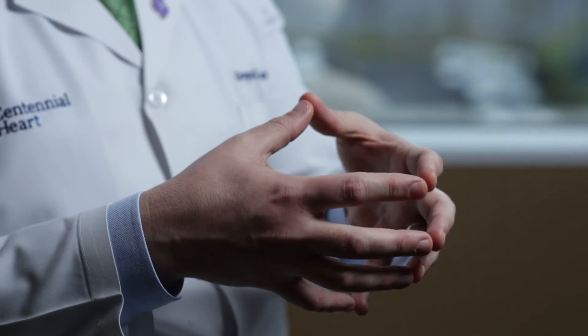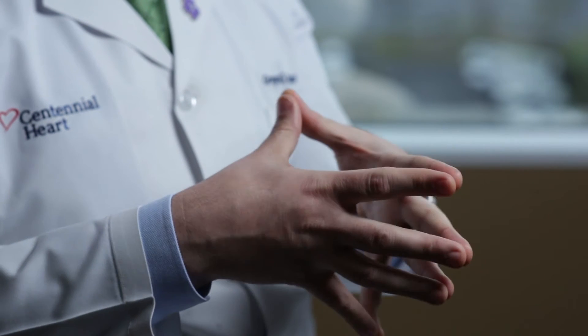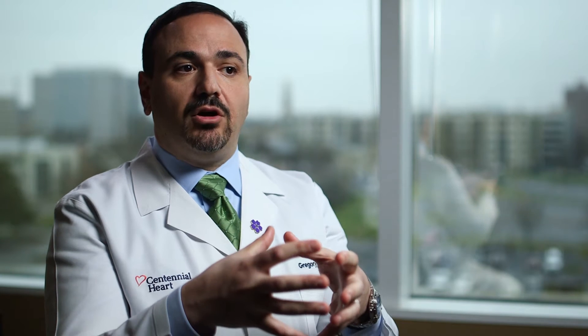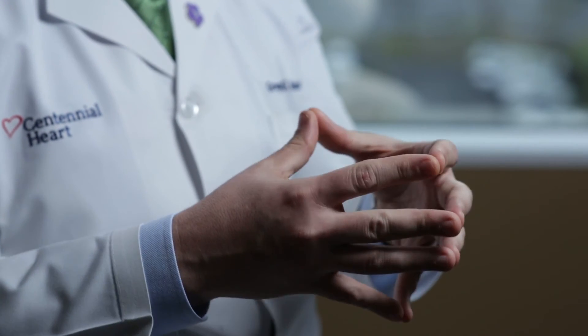Cardiac resynchronization, or biventricular pacing, refers to a special kind of pacing of the two bottom chambers of the heart, known as the right and left ventricles. When we are born, the right and left heart typically beat at the same time. Some people can develop an electrical disturbance such that there's a delay between when the right and left sides of the heart beat. In people who have weakened heart muscles, this can lead to worsening pump function of the heart and often symptoms of congestive heart failure. By resynchronizing the right and left ventricles so that they beat at the same time again, most patients get an improvement in the pumping function of their heart and ideally an improvement in their symptoms.